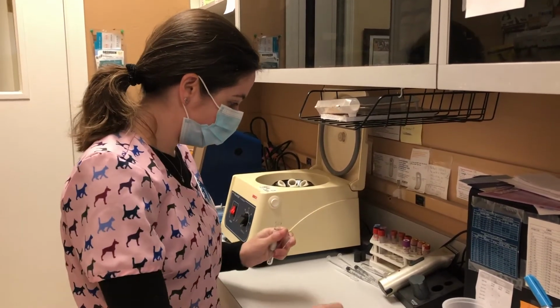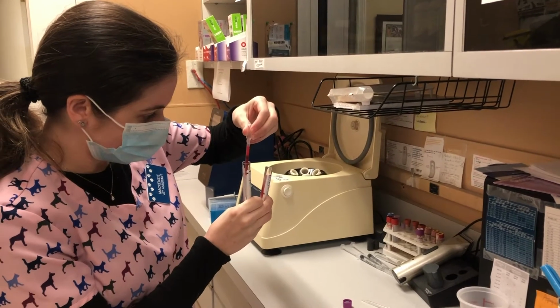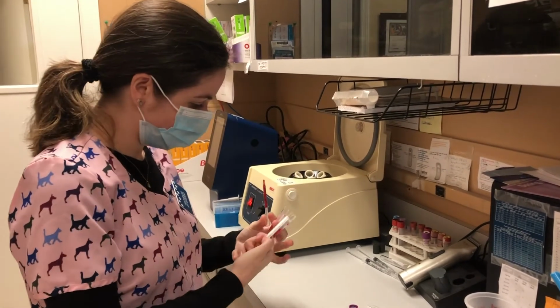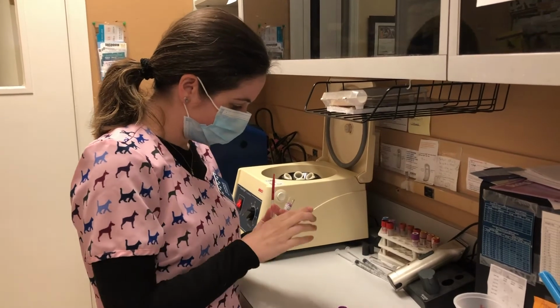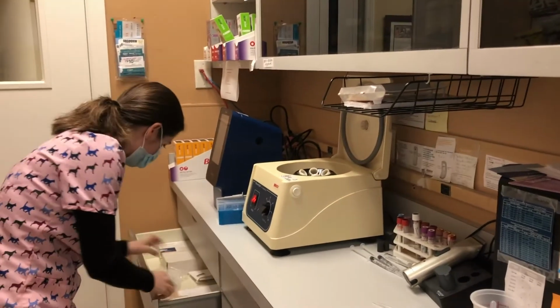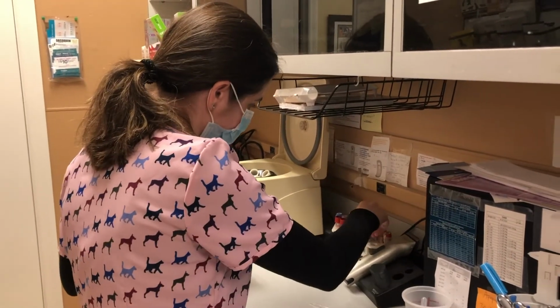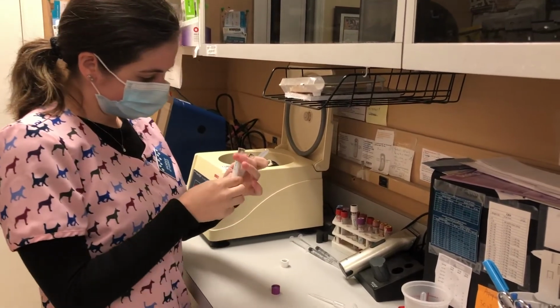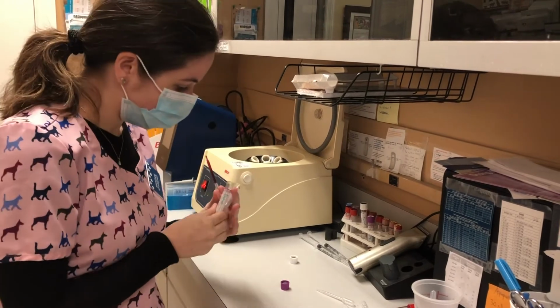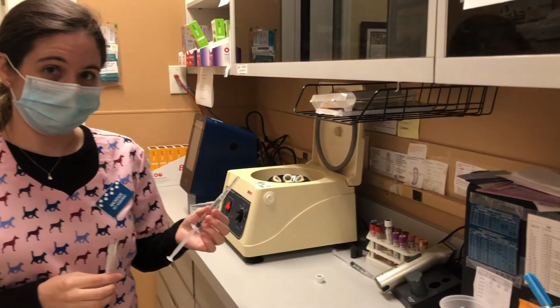That's for the donor. Now I'm going to fill each of them up with my 0.9% sodium chloride, my saline solution.